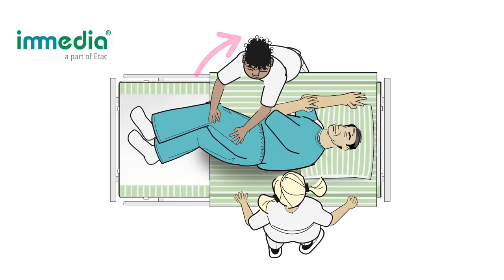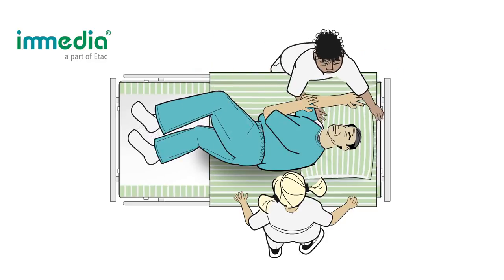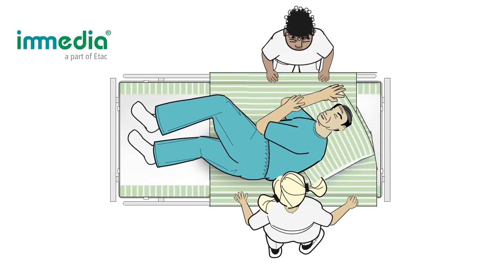If the user has to stay in this position, use a positioning wedge or a pillow behind the user for support.